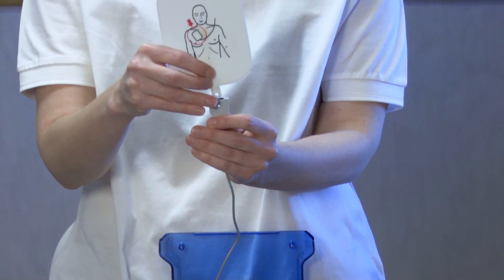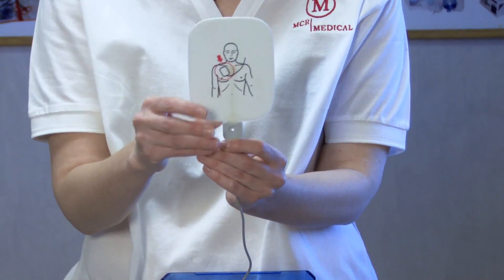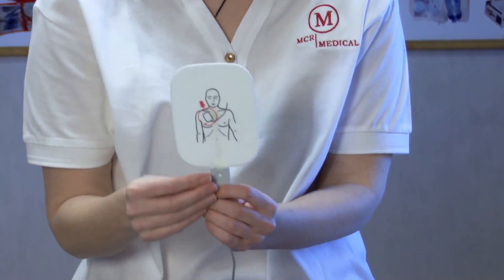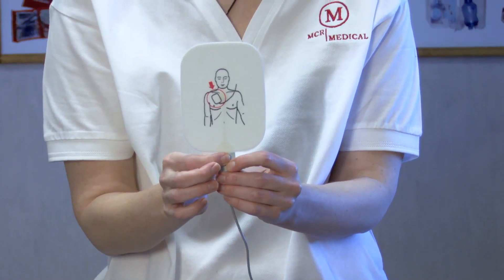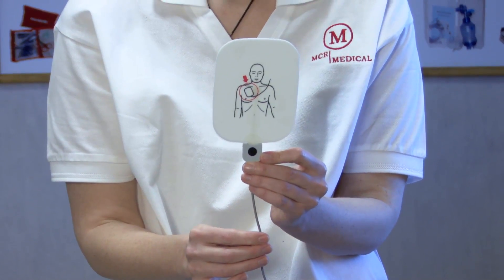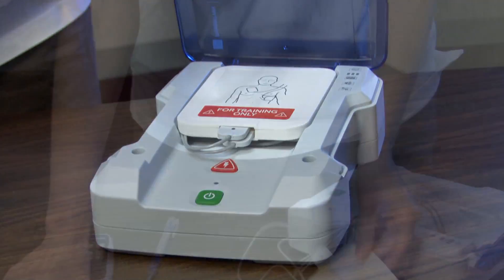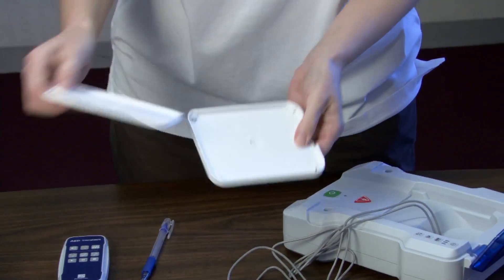Repeat this operation on both AED Training pads. The pads are now connected to the unit and will not be disconnected until you're ready for new pads. To keep your pads clean and protected, they'll be stored in the unit's training pad case. First, open the white plastic training pad case found in the unit.